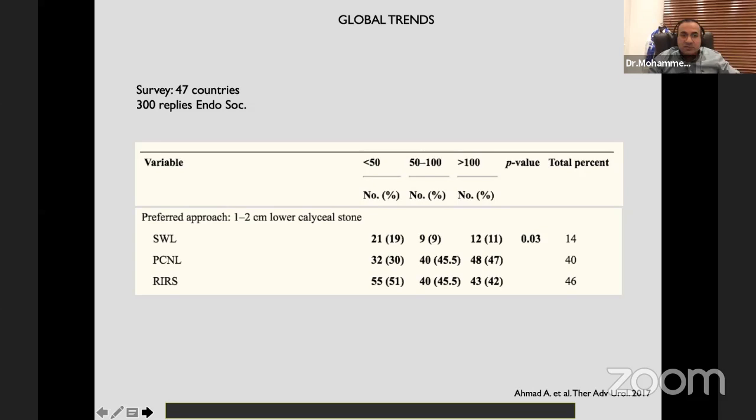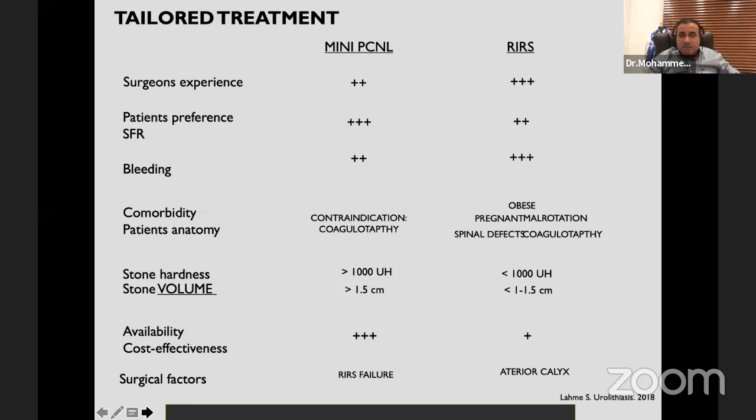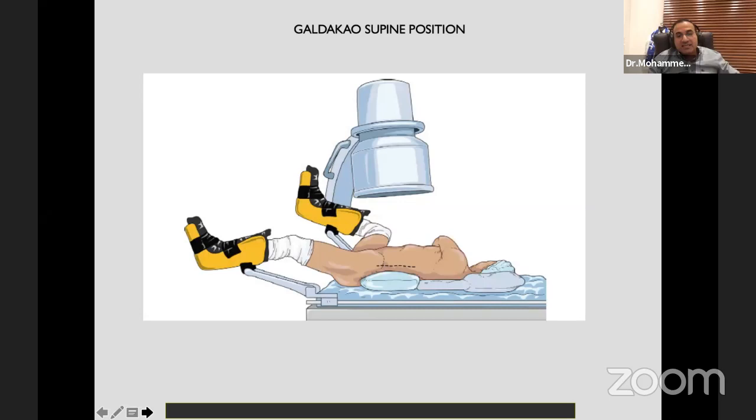Comorbidity in the patient: flexible ureteroscopy, as I said, is ready for all. It is made for all body shapes and any anatomical shapes. So this is from one of my colleagues. He sent me this picture. He said, I perform flexible ureteroscopy, and then if it's hard, I convert it to the mini PCNL. And they wrote in the paper about the cost-effectiveness. I totally disagree. He wasted a few thousand on the floor.